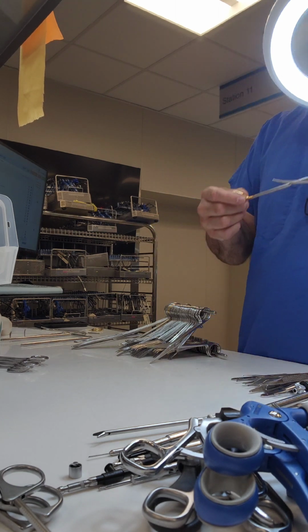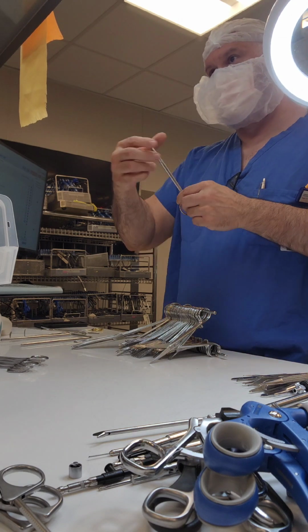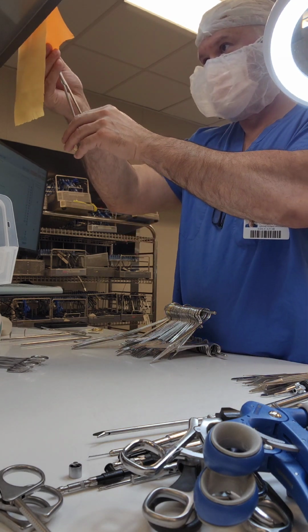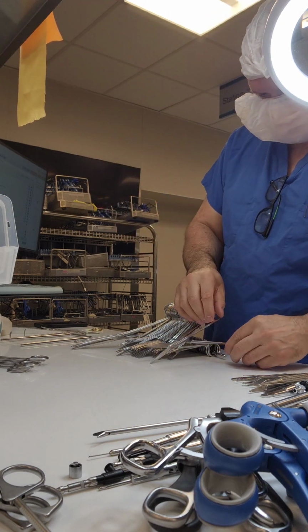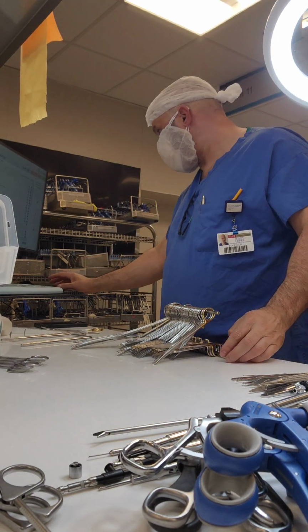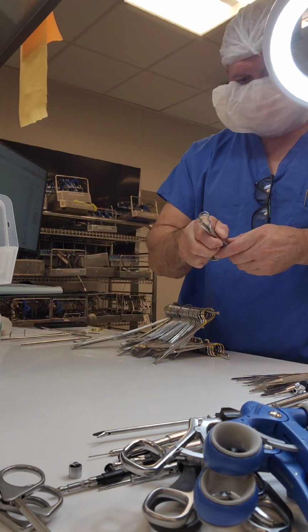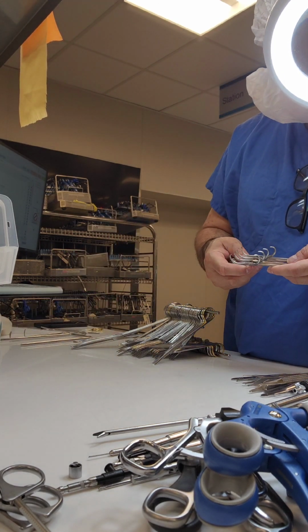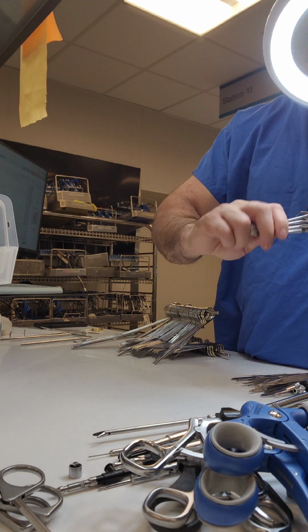So again, even though I got that scissor off the backup wall, still inspecting it for cleanliness, still testing it for the drop test, still sharpness testing, because scissors and instruments move in and out of the backup wall. Not everything back there is brand new. Not everything back there is clean. Some people, when they shouldn't, throw those instruments back there when they're not clean.